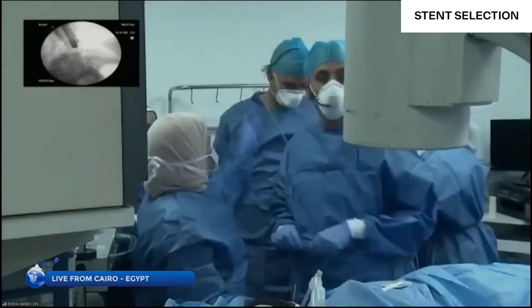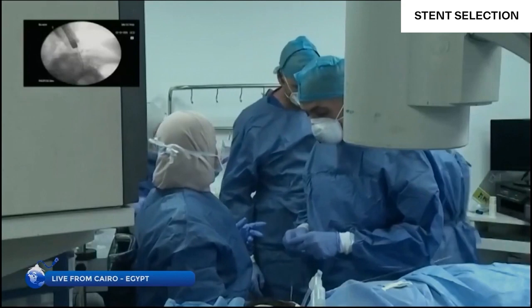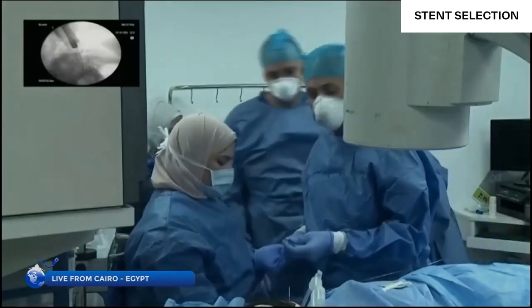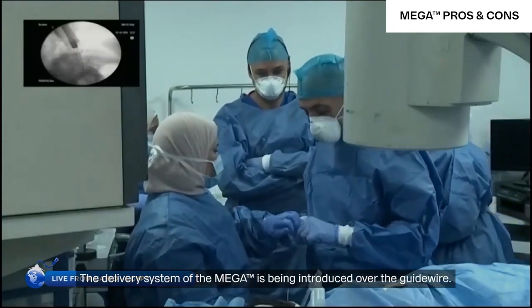The fully covered one or the partially covered one. I'm using today a fully covered TaeWoong stent. For the sake of Hani first, I will put his stent, not my stent, just to show the friendship. I would say there are pros and cons.